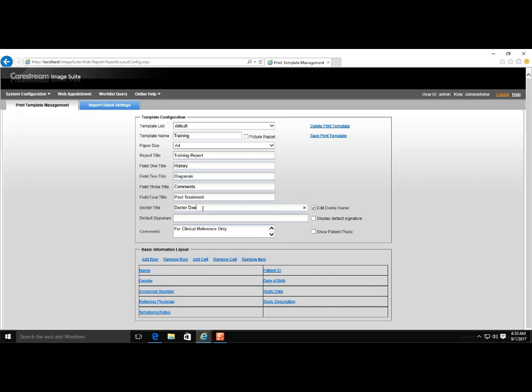To add or remove rows and cells, or to change the fields in the report, use the Basic Information Layout screen. In this demo, we have a blank cell.